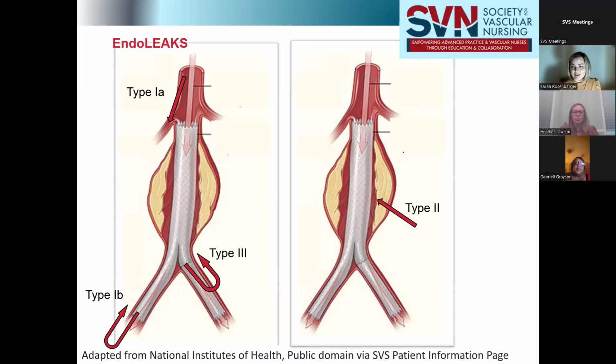The second thing the patients will say is, you didn't do the surgery right 10 years ago when you did my EVAR because now I have an endoleak. We didn't actually fix the biological problem that is aortic aneurysm. What we did was we took the pressure off the area of disease to prevent rupture. And if we fast forward in life 5-10 years, this part or this part can similarly become diseased. So the area that we were reliant on the stent graft pushing up against the aortic wall, if that aortic wall becomes weaker over time or aneurysmal, then this is sort of just floating into space.